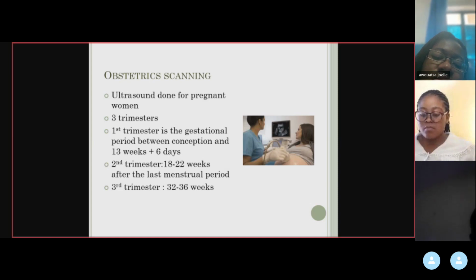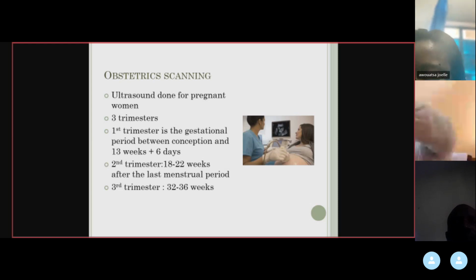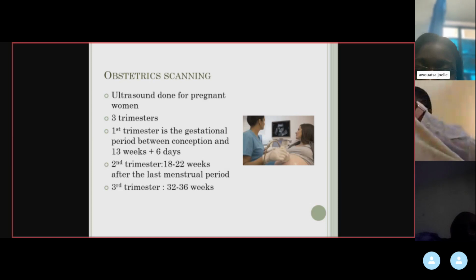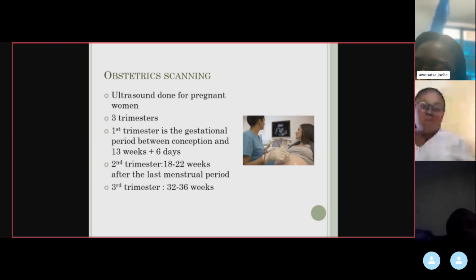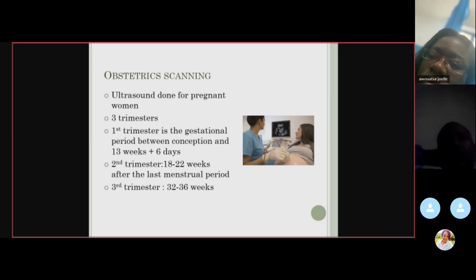What is required whenever we are doing an obstetric ultrasound is that we have to know the last menstrual period of that female. That is, once the period cycle gets over, from that day we have to calculate the growth of that baby. So that date is very important. That is the LMP.